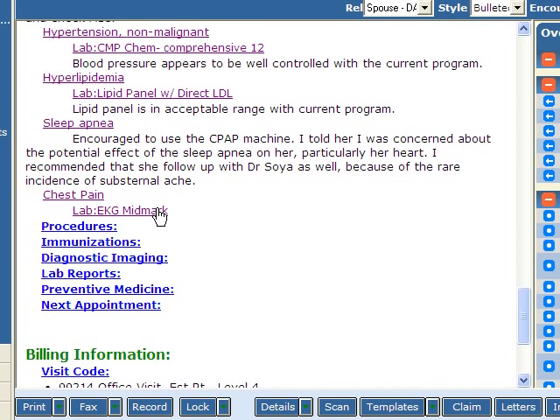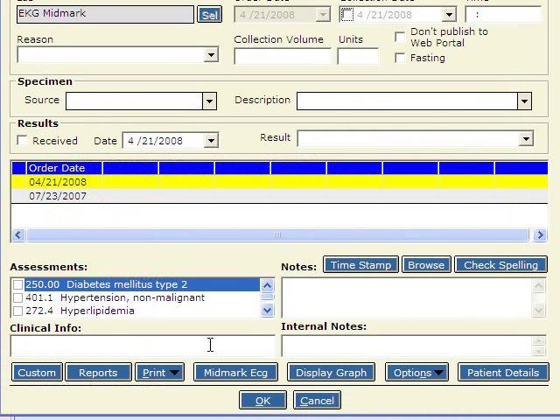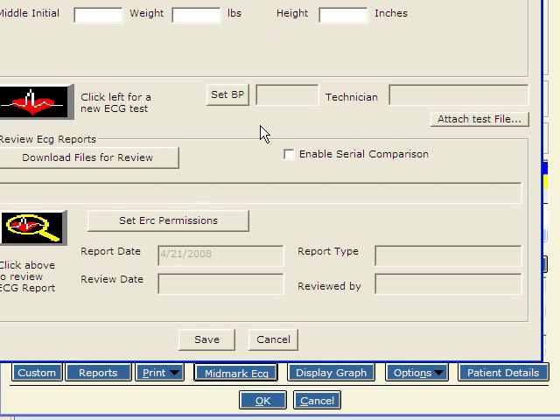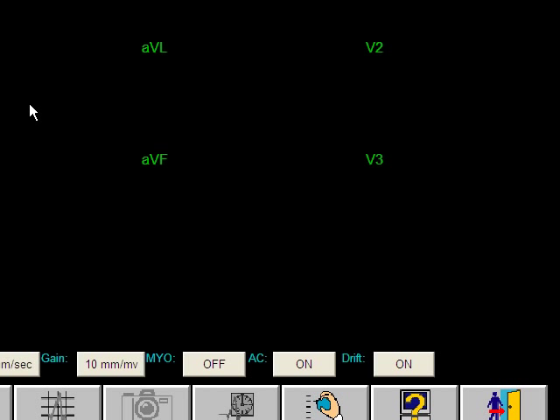And we'll click OK. Now in the chart, you'll see under chest pain, lab, EKG Midmark. Let's double click that and you'll see the lab order screen. We'll click Midmark. You have a choice of a new EKG or to review old ones. Let's create a new one.